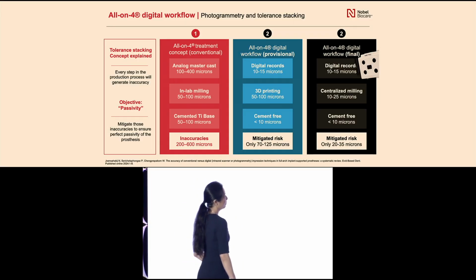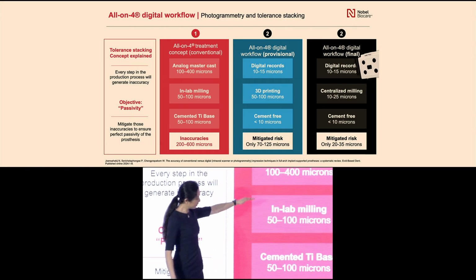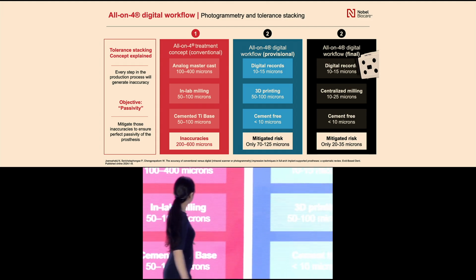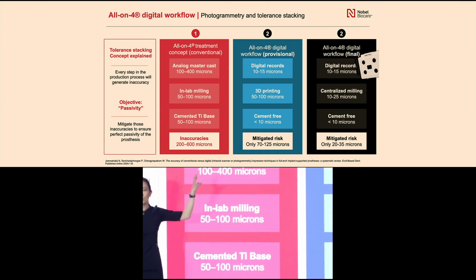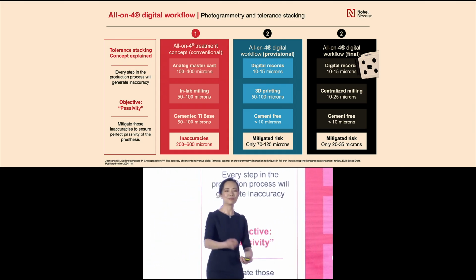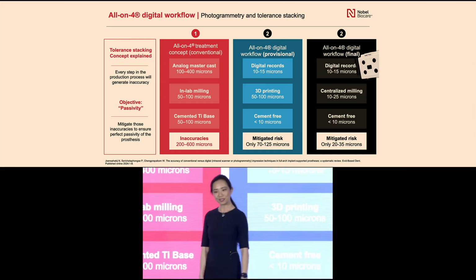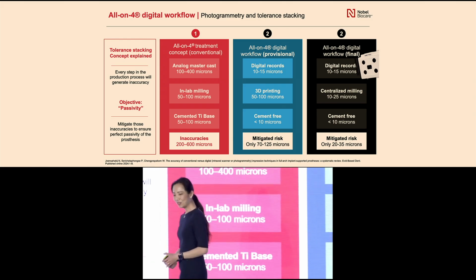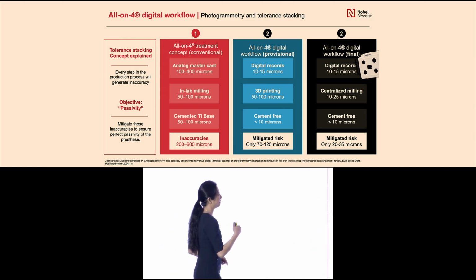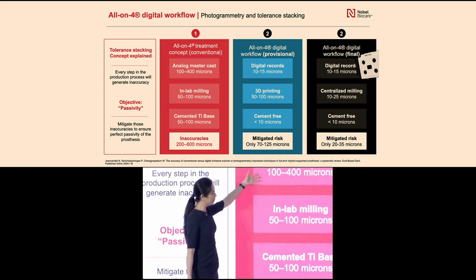So if you were to look at just fabricating an all-on-4 type prosthesis, these are the cumulative errors that can occur over time. What you'll see is that even if you had the perfect impression poured, what if your technician was really ham-handed and didn't make sure all the analogs were seated, or maybe they're really upset at you and poured up the stone and just slammed it onto the bench top? Will that move your components or change your impression even if the PVS is perfect? Totally, right? Or what if they decided that they wanted to pour it in Die-Keen, which is a type 5, or not type 5, but it's a very large expansion stone? What will happen there? So when you look at master cast, there's a lot of variation.